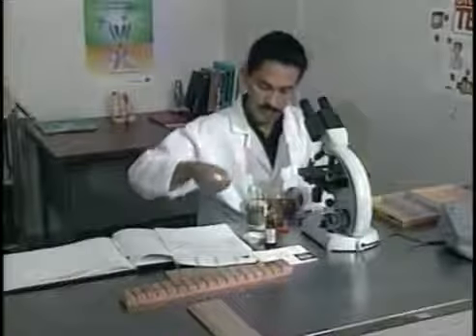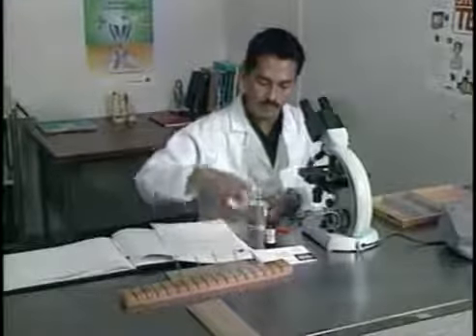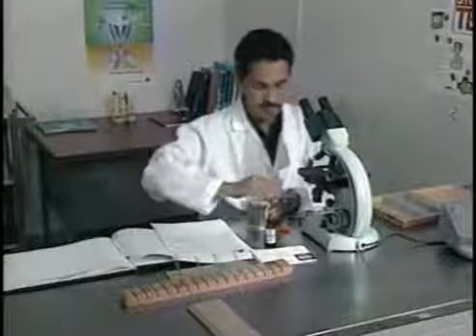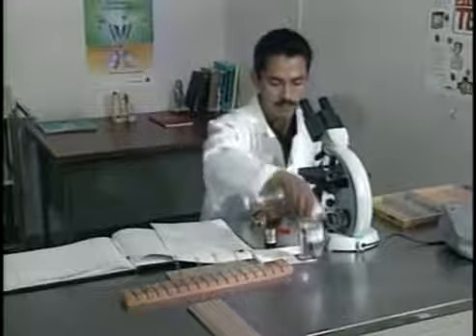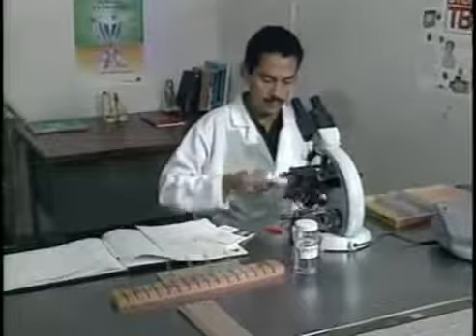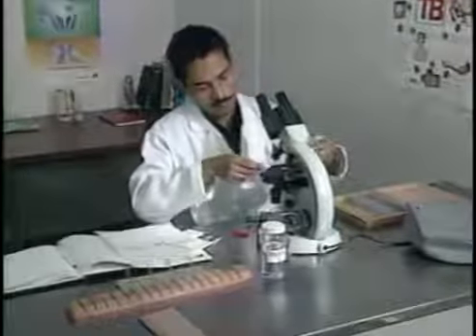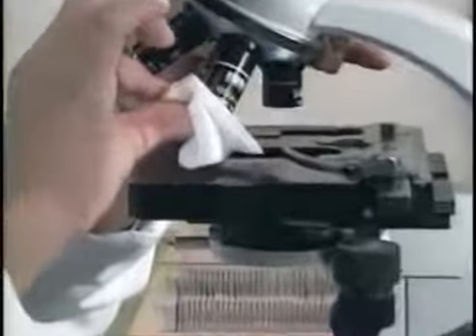When dried, place the slides carefully in a slide storage container for transfer to a referral laboratory for quality control. This must be done on a regular basis as determined by the National Tuberculosis Program. Before examining the next slide, wipe the immersion lens with lens paper. This will protect from carryover of organisms that could create a false positive reading.